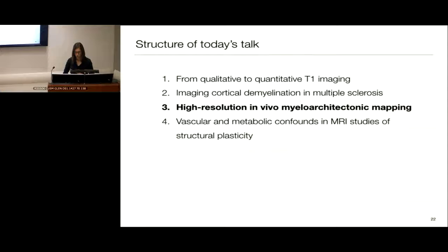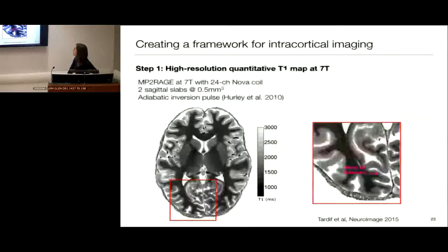So that falls into this next step, where I developed some techniques, actually mainly analysis techniques, to start to analyze that high resolution data. So I moved to Leipzig, and there they had already been working at 7T for several years, and started working with the MP2RAGE sequence that was actually developed by Marques. And it allows us to acquire T1 maps at 7T that have minimal B1 effects.